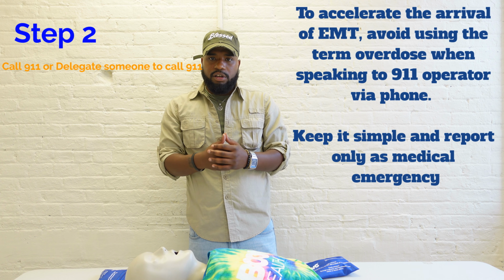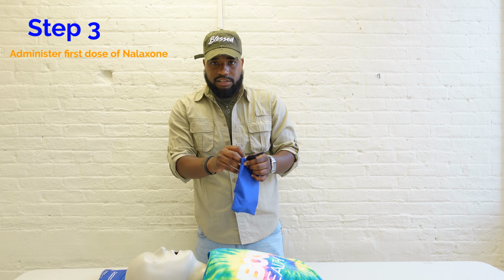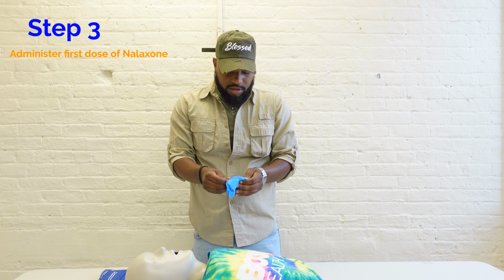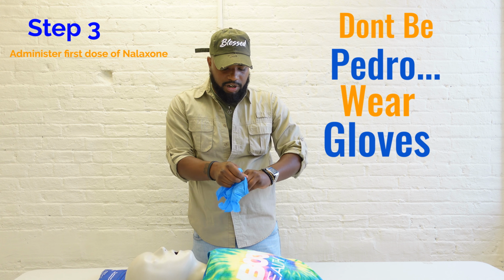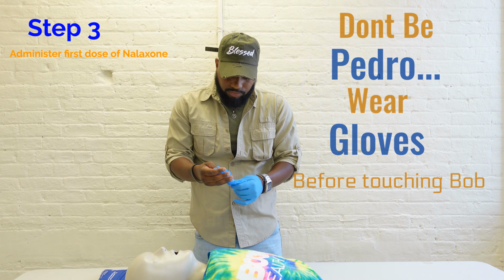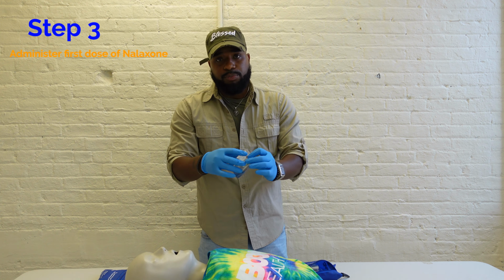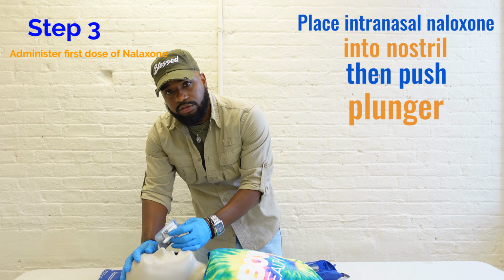Step 3, you want to administer the first dose of intranasal Naloxone. Make sure you have your gloves on. All this is you should probably do initially. You want to make sure you have your gloves on. You're going to open up the intranasal spray. At this point, you're going to push the plunger on the intranasal spray into the nostril.